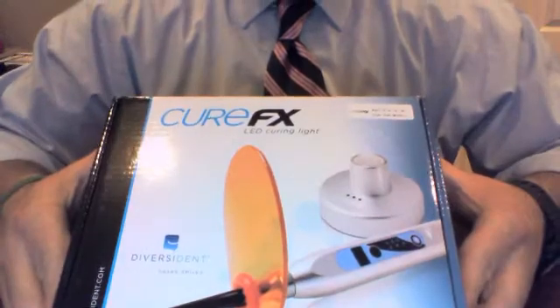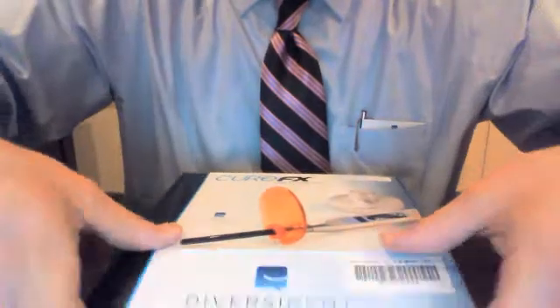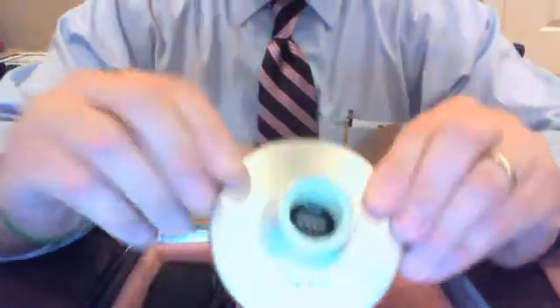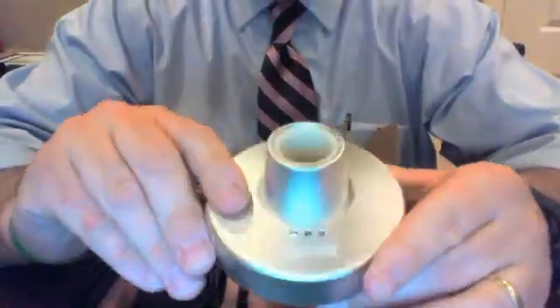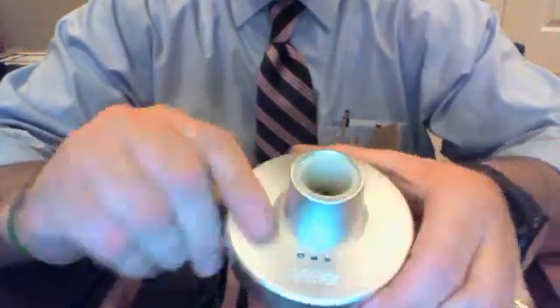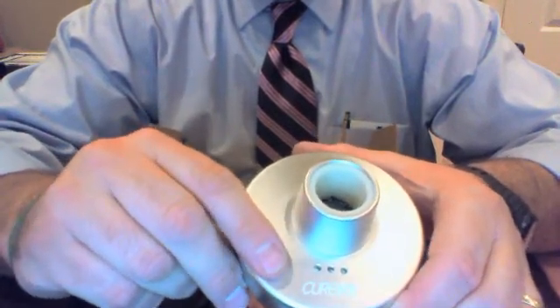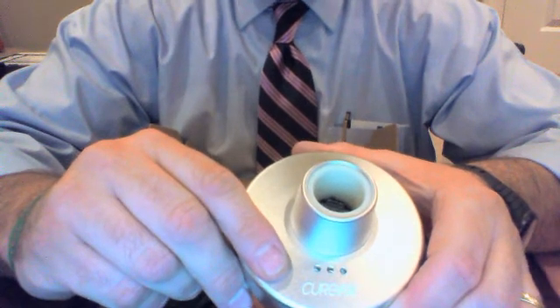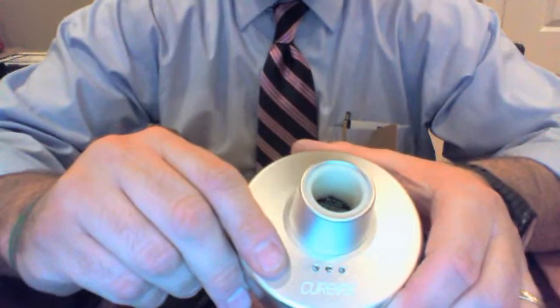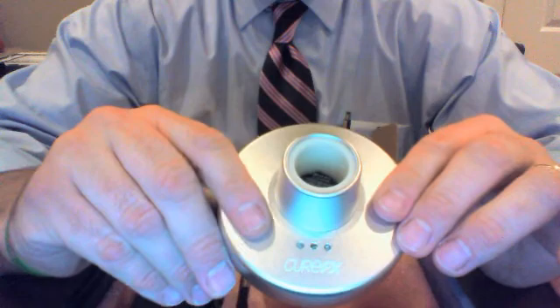This is how the package arrives — the CureFX box. I'm going to open it up and share what's inside. The CureFX Light comes with your standard base. It's an aluminum-coated base, very sturdy, and you'll see it has three different LEDs at the bottom. The farthest to the left is red, the middle is yellow and lets you know the unit is charging, and the farthest to the right is green and lets you know your light has fully charged.